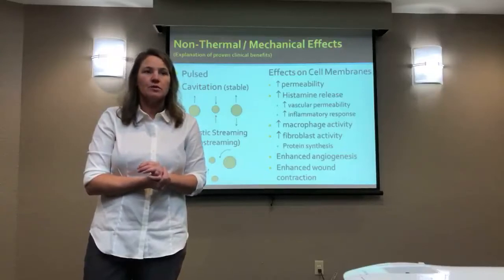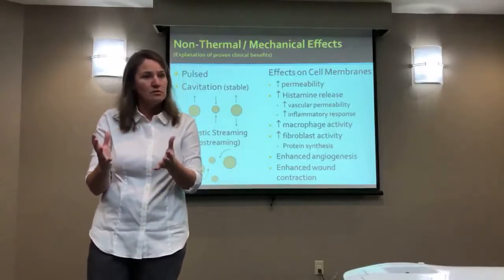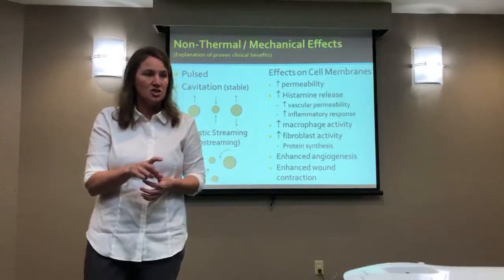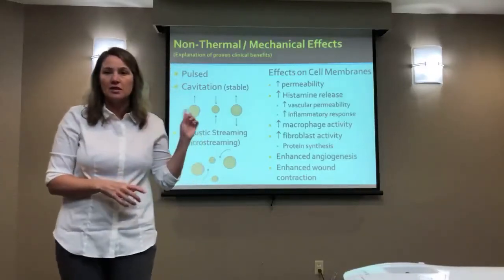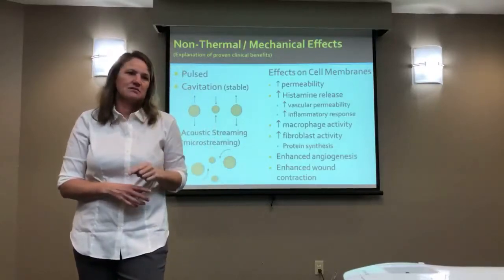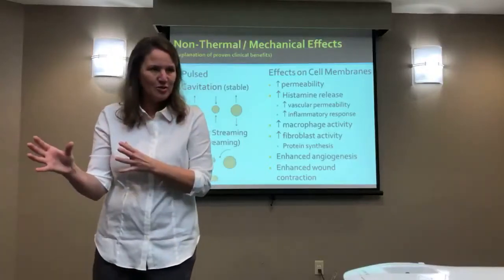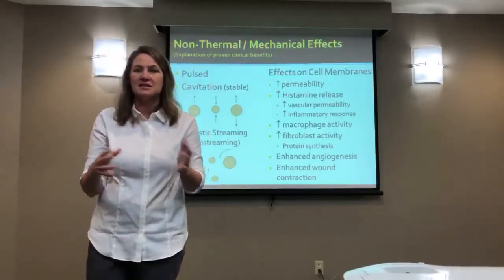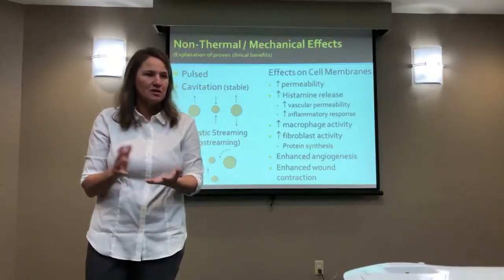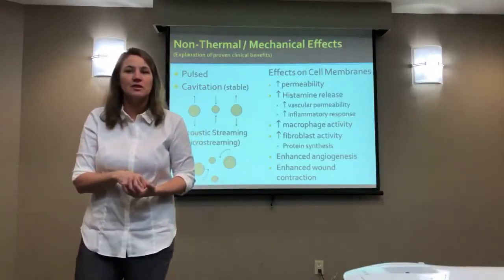So you don't want to throw out, what is that saying, the baby with the bathwater? You don't want to throw out the results of these studies that were actually well designed. What you want to do is provide a new explanation and discussion and say, well, if we go back and look at these clinical benefits that were proven quite well, it wasn't heat. It couldn't have been heat, because if these machines work the way our machines are working, they found that at any intensity, at a 20% duty cycle, there just wasn't enough heat to possibly cause those benefits. So they went back and tried to explain the already proven clinical benefit.